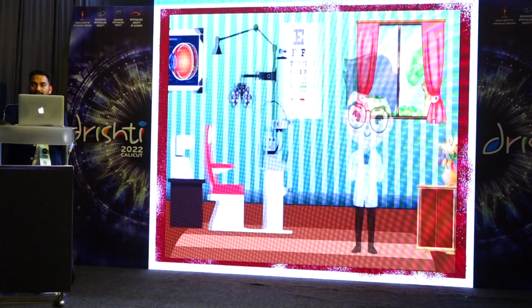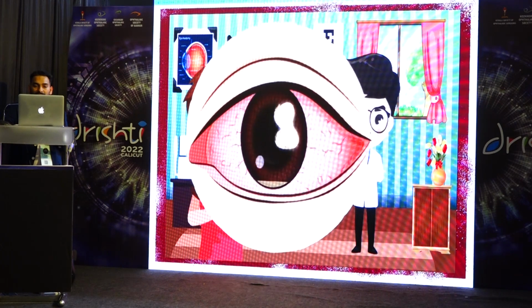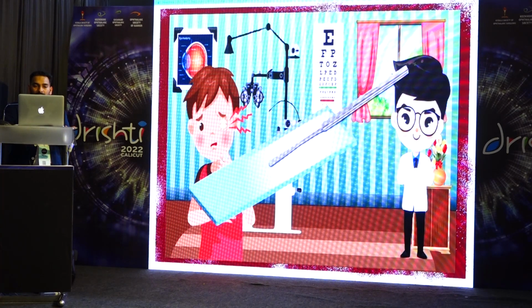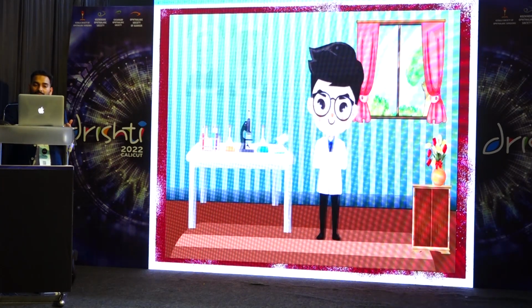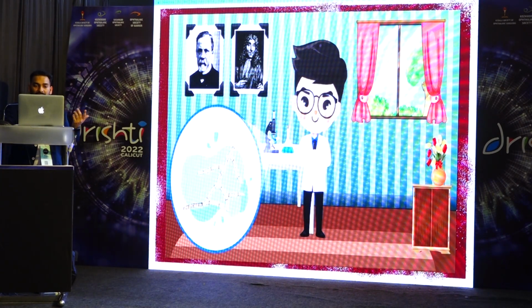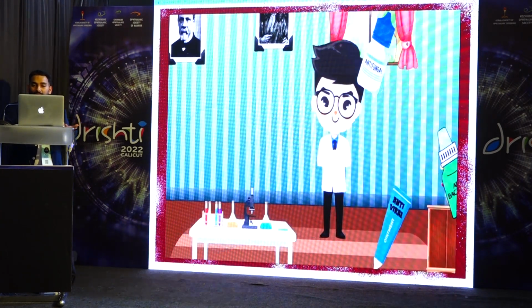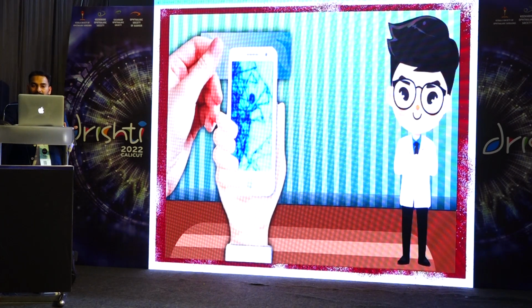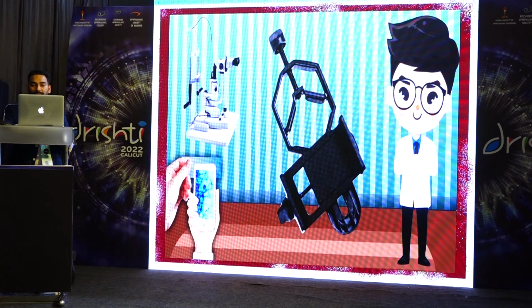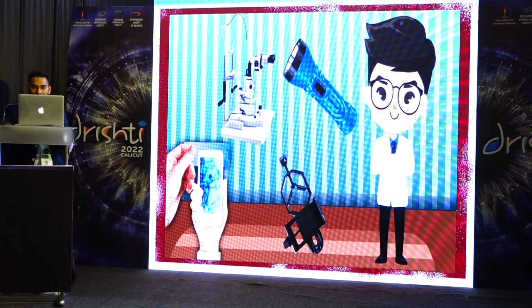So how the intraocular lens, the IOL scope, can be used on a slit lamp, like on our own slit lamp, to convert it into a point of care diagnostic tool. As we know, we do scraping, and if we have a microbiology lab in our institute, it's well and good, because you can go and check. I don't know how many people actually have a microscope to check the fungal hyphae in their own clinics, but I know for a fact that it is lacking in most clinics. So why not use the IOL scope for the same? We need an adapter, a torch, and an IOL scope, which we have already made.